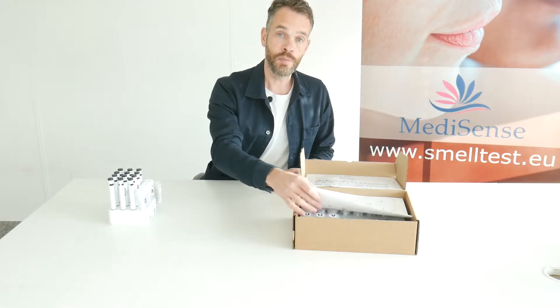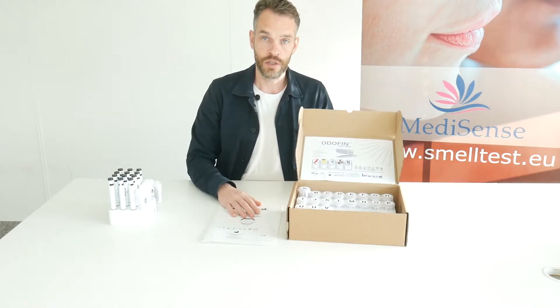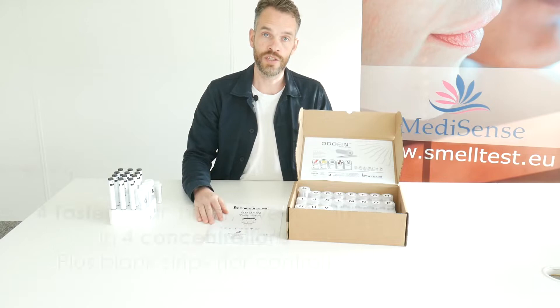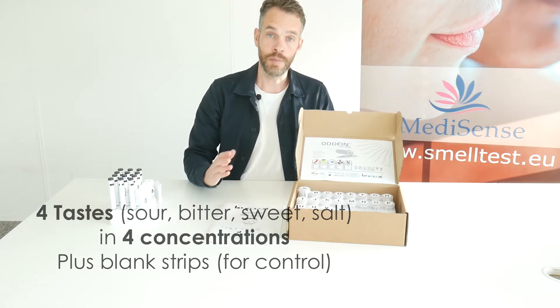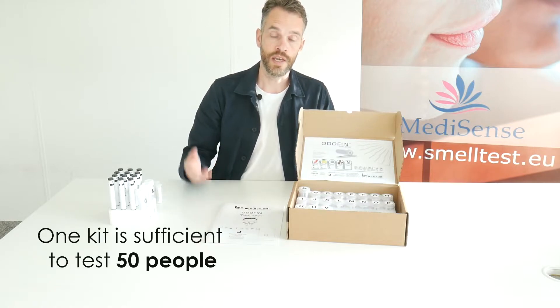The most complete kit is shown here, which is the taste strips kit with four different tastes in four different concentrations plus the control taste strips. These basic tastes are sour, bitter, sweet and salt.